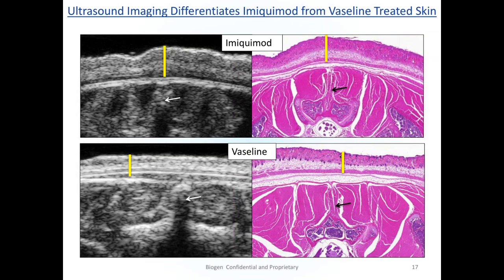They were hearing from their clinical colleagues in the field, the dermatologists and the rheumatologists who were studying this disease, that they had been a little frustrated by their ultrasound readouts, but I think that they weren't using higher frequency ultrasound at that point. This was a couple of years ago, so I think that things could have come along considerably. I think just longitudinally measuring the changes in the skin would be a great advantage for people studying that disease.